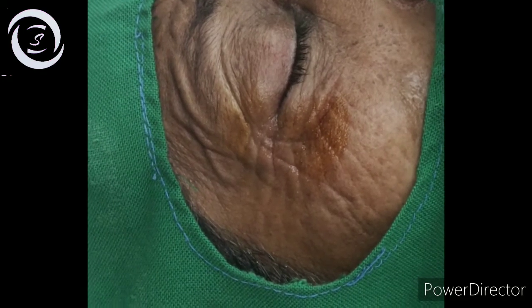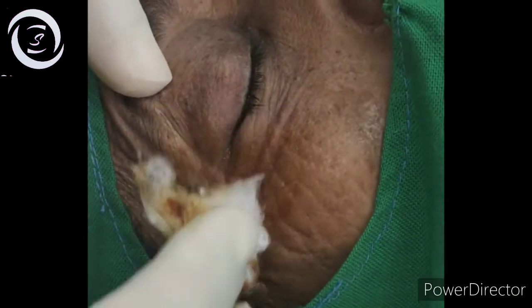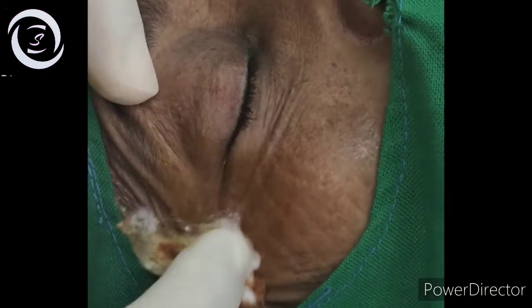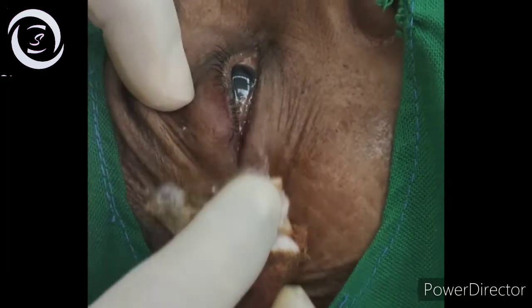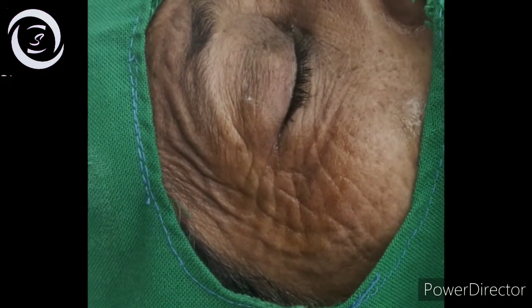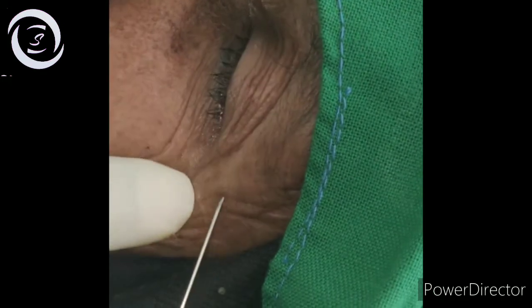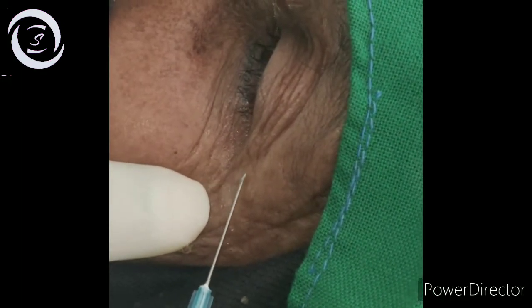3 to 4 ml is typically more than sufficient in this modified Van Lint technique, and it has fewer complications. There are two types of facial anesthesia: the Van Lint technique I have shown, and the O'Brien technique.